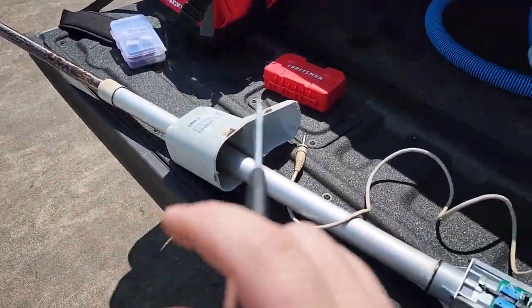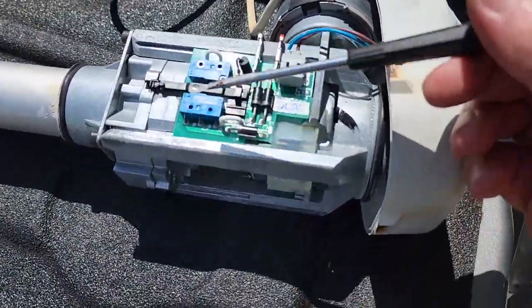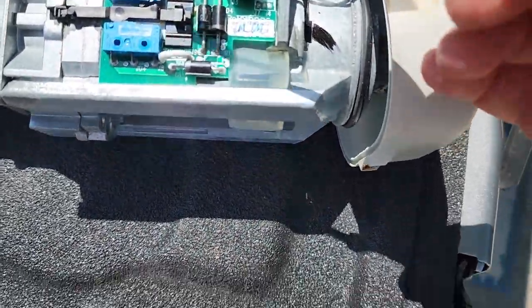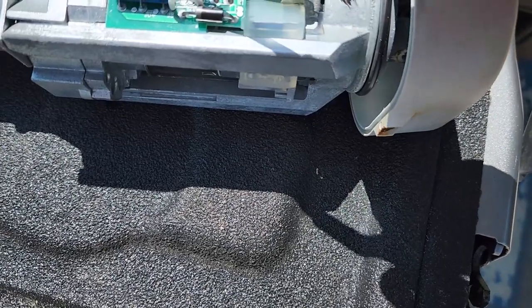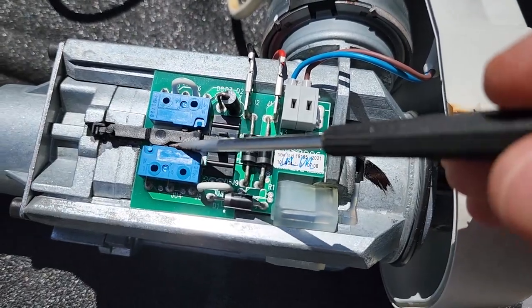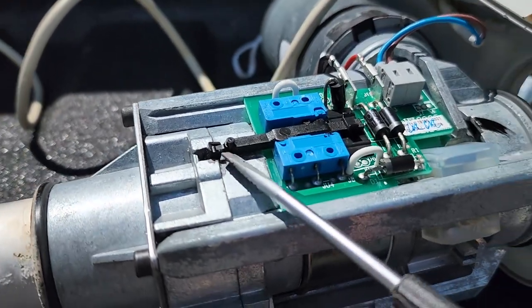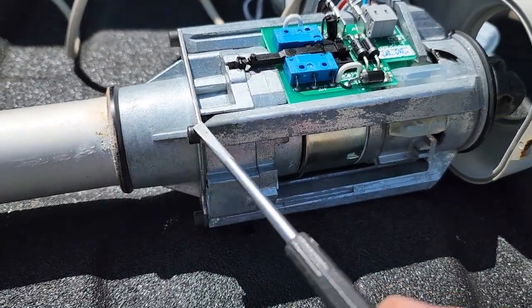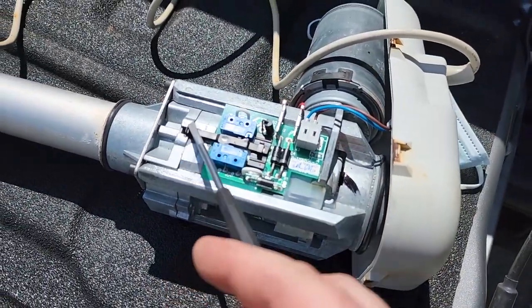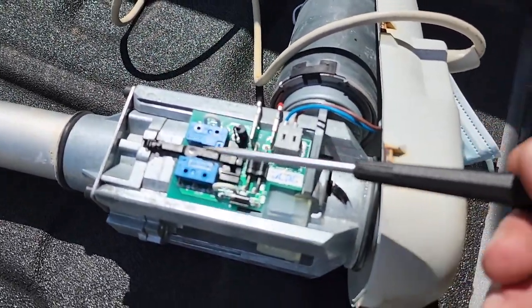One of the things that you guys should know is that all linear actuators have limit switches. And take a look right here. They've got this one, and I don't think they're labeled, but I can tell you for a fact that this one right here is not actuated. So that's the down switch. And this one here is in a constant depressed condition. So what I've got to do is right here, you can see that it's kind of stuck. I've got to take off these Allen fasteners right here, separate the clam, and clean out whatever is causing this little detector to not slide up and down.